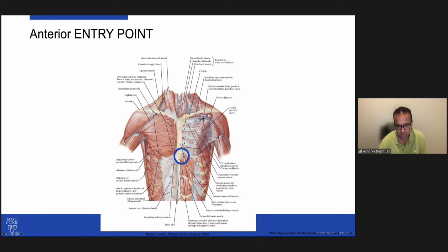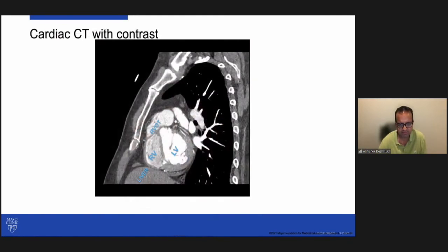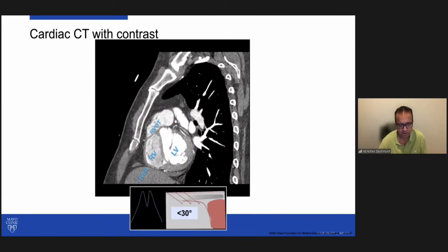Now, the diaphragm is almost like a shape of a parachute in this location. So at the thinnest portion here on the left parasternal space, you could by blunt dissection cross this, and then you may end up in this retrosternal space where the lead would get deployed. Certainly, cardiac CT is paramount before doing these procedures, and you would know the exact course that how you're going to go behind the sternum in the retrosternal space and not towards the heart to minimize the risk of perforation.